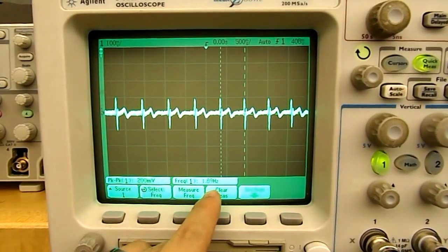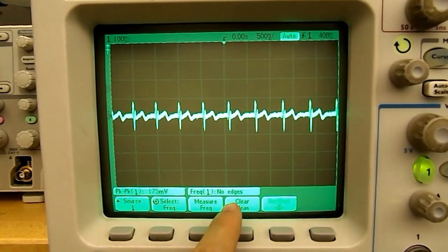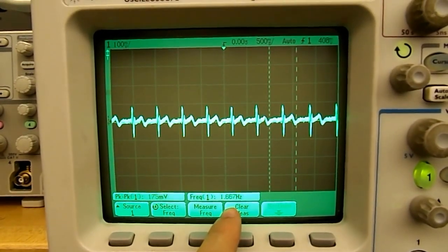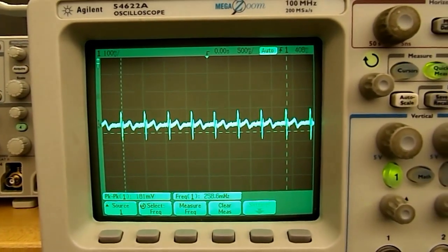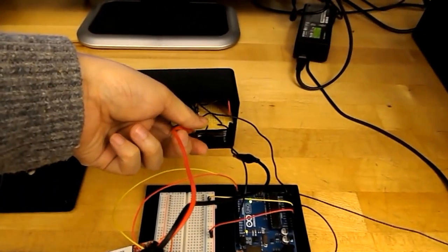This is the frequency right here. If you can zoom in, it's about 1.6 Hz. 1 Hz is 60 beats per minute. Right now if I disconnect the oscilloscope there should be no signal.